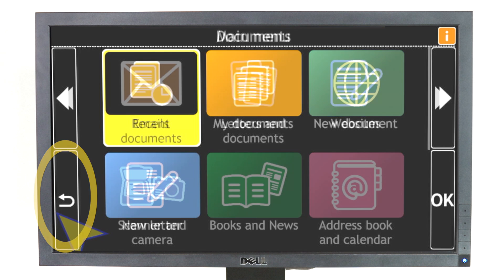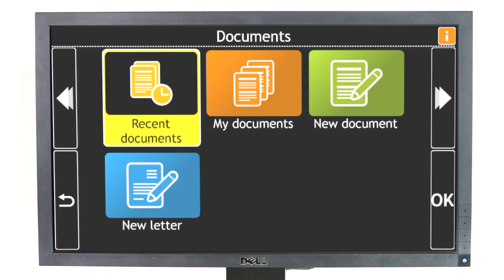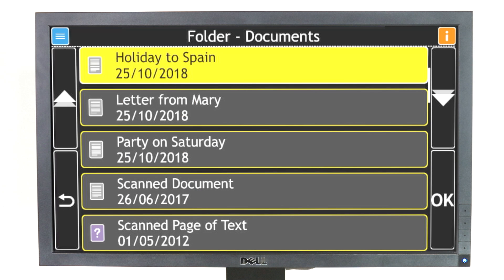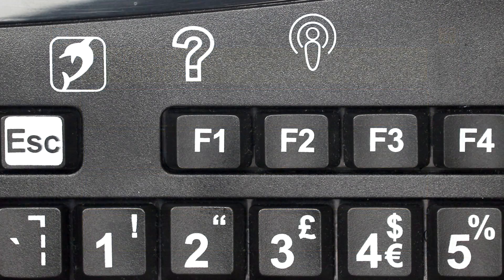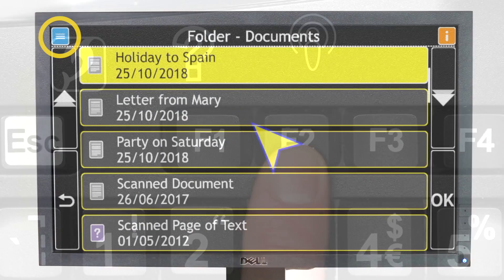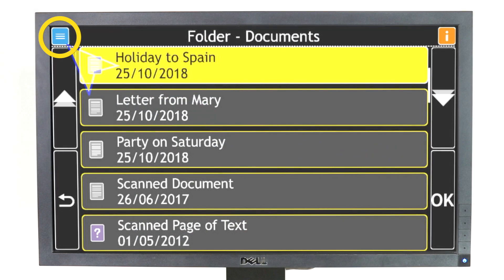When you move to a certain screen, GuideConnect will tell you when actions are available. Select Document to open. There are actions available. To open the Actions menu, press F2 on your keyboard or click on the blue button at the top left of the screen.